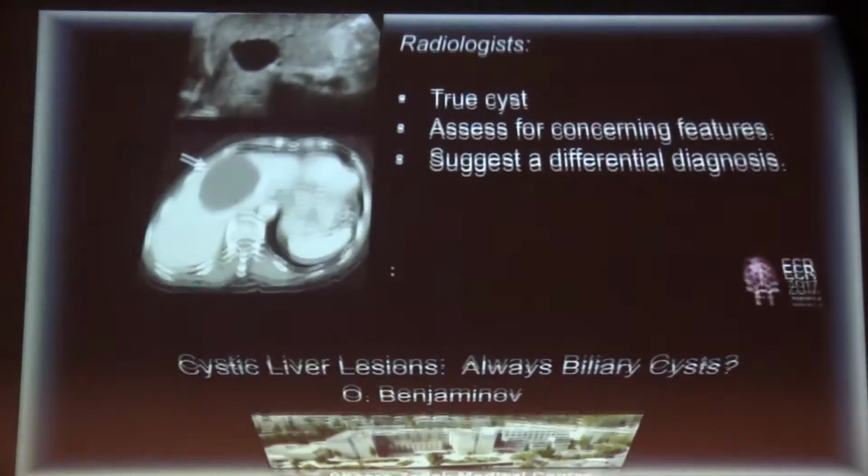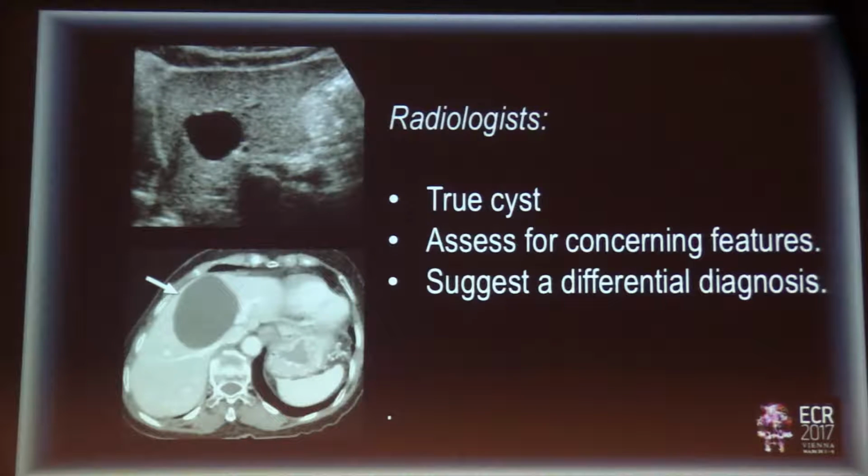And the main role of the radiologist with these liver cysts is to assess for concerning features and to suggest a differential diagnosis and mainly to give recommendations when further evaluation, investigation, and intervention should be performed.